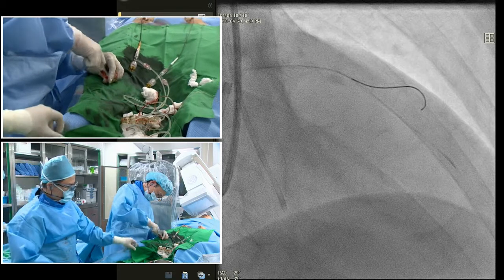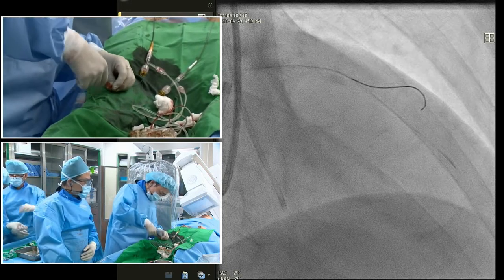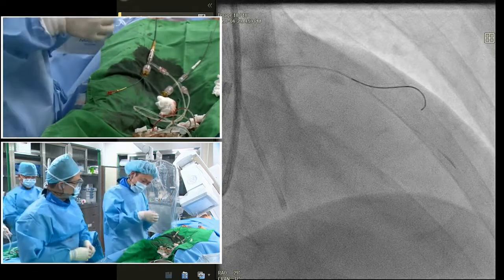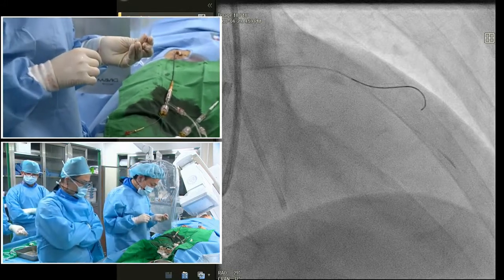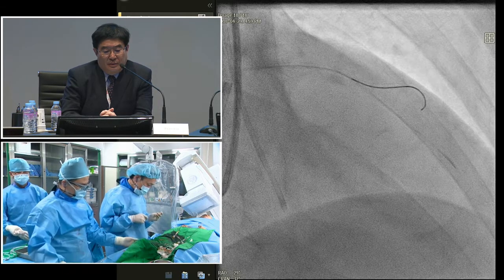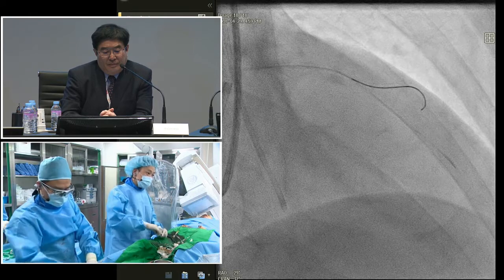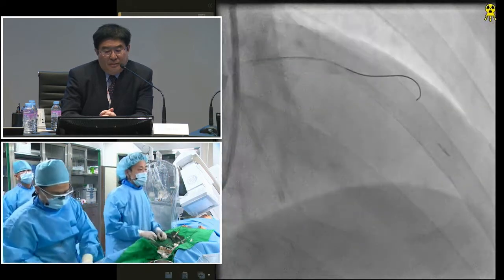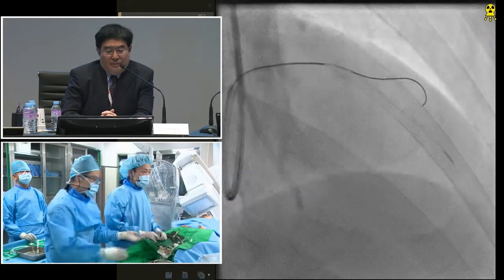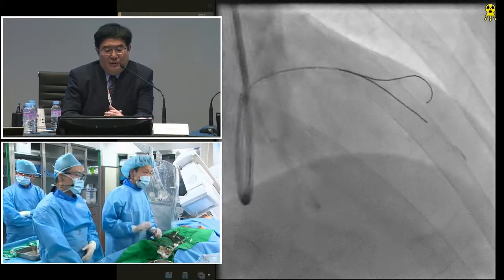Okay. Maybe it's touching, let's put it in a little. Oh, sorry. Will you do the tip injection? Yeah, but maybe the tip of the catheter is hitting the arterial wall, so I want to insert the wire again. This is the shown blue. But I think this procedure would be safer. You want to see? No. I personally don't do the tip injection.